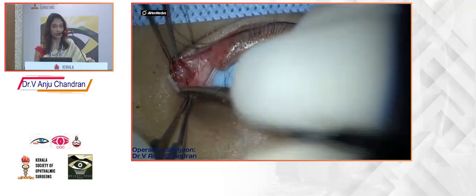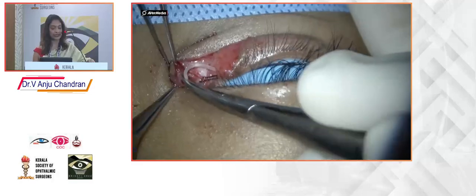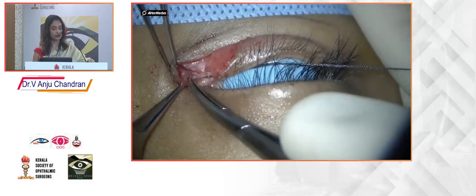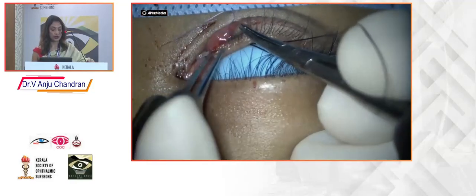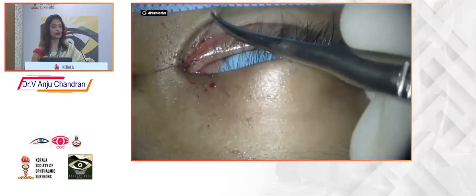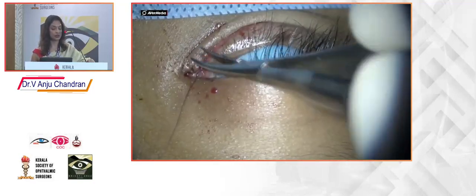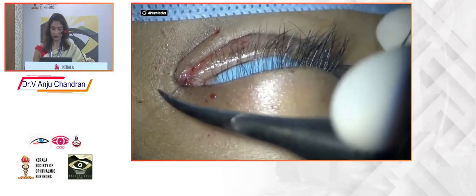I like taking traction sutures so that I can see the distal end better, and then gently ease the edge of the Monoka into the distal end. The next step would be to take pericanalicular sutures. This is usually taken with the 6-0 Vicryl that comes with the Monoka. Make sure that you keep the tissues close together when you tighten the knots, or it can lead to cutting of the tissues. The rest of the repair is as we saw in the lid repair.